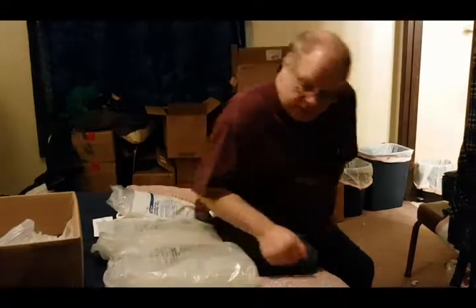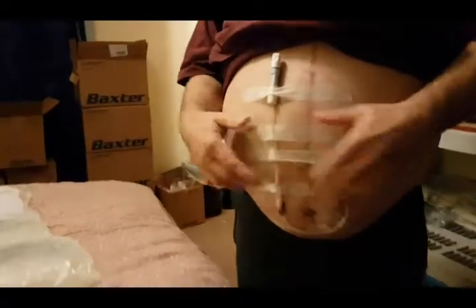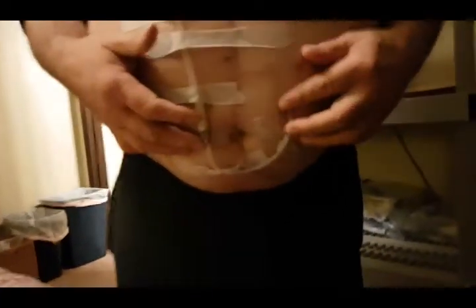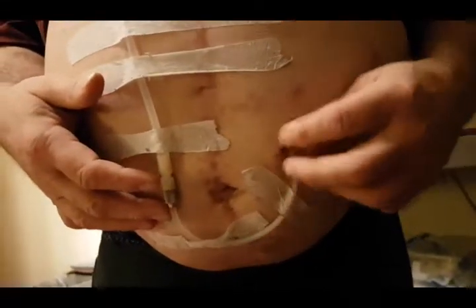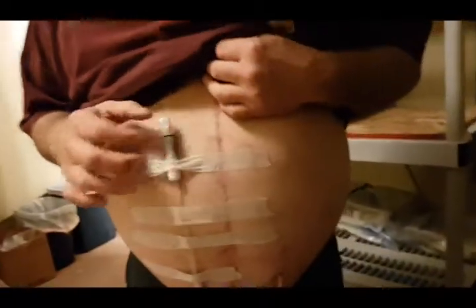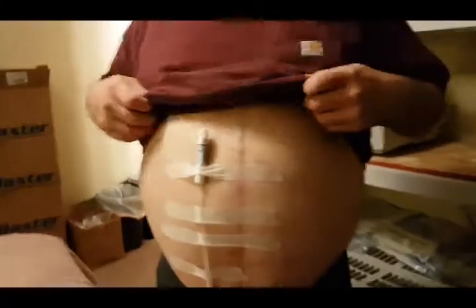a couple minutes. So, at this point, I'm going to set it all up, but I'm going to let you see the catheter first. I keep mine taped because the PD belt they give me drove me nuts. That's where it goes in. You want to take good care of this spot right here. No tugging on the catheter. Anyway, that's the catheter. It gets checked every month.